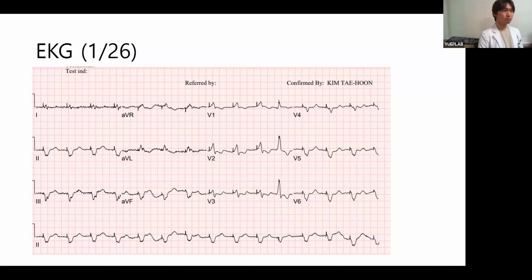Actually, the world changes very quickly, especially the part of CIED heart. So all the EP doctors, including me, should study harder and learn more. And the foreign fellows requested that they need training for the programmer management. So I asked the company, after the EP procedure, somebody will come to you and teach you and give you the opportunity to simulate with the program. Okay.